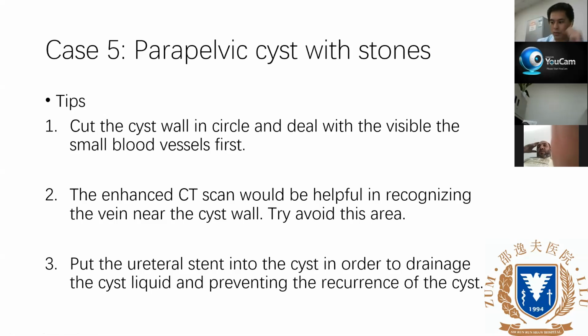I also remind you, if there's a stone in the cyst, you need to pull out the stones completely, because a stone left in the cyst may grow again.